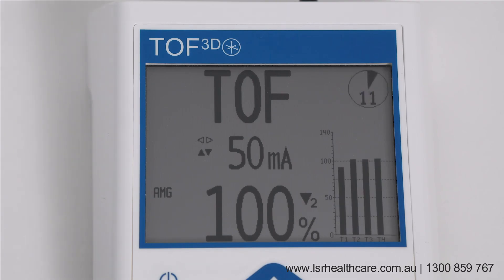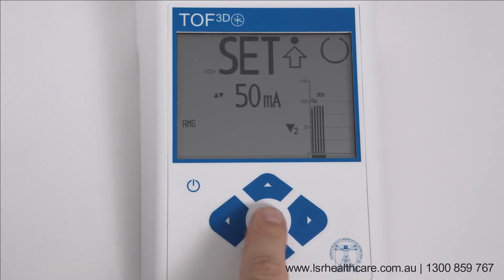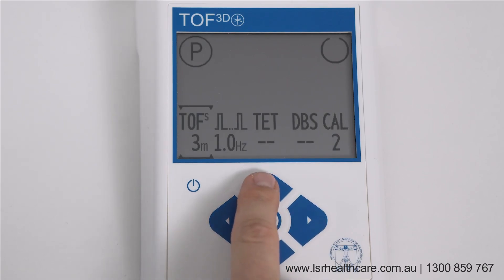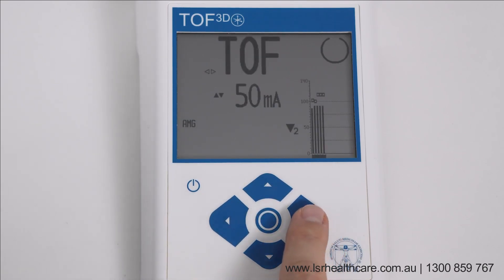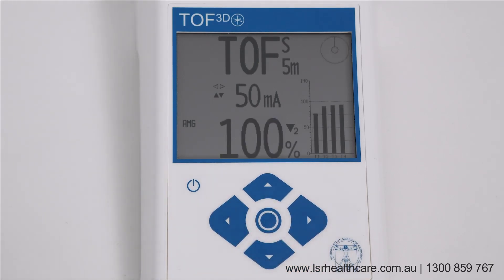Stop continuous TOF mode by pressing the center key shortly. To set an individual TOF interval, define your own interval in the settings menu. Select P for parameter settings. Use the up and down keys to set your individual TOF interval and confirm using the center key. Then go to TOF interval mode and start interval measurement by pressing the center key for one second.